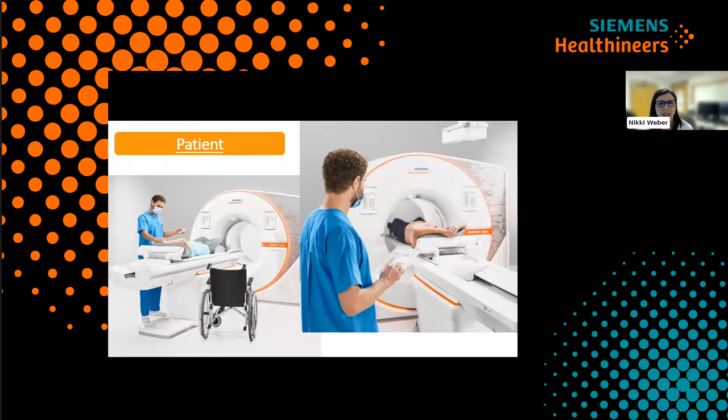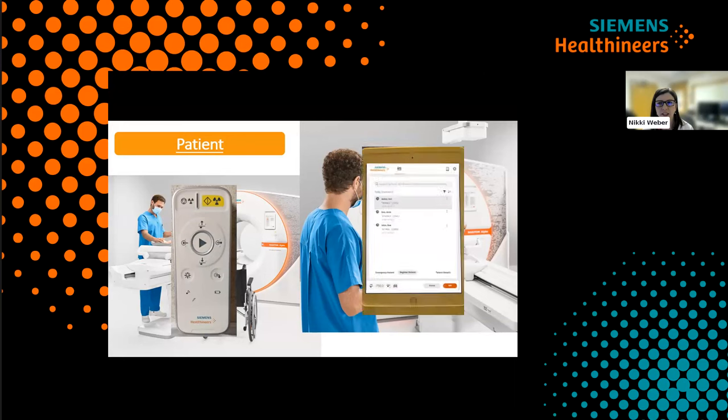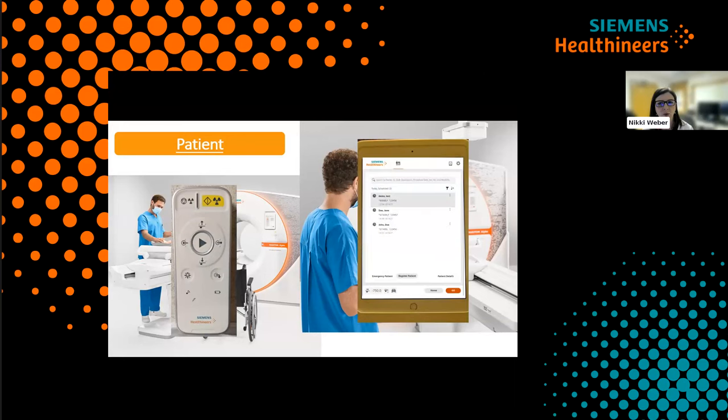So here, the Scan and Go workflow starts in the room when we greet the patient and set them up for their exam. The technologist on the left is focused on the patient's needs while moving the scan table using the remote. The technologist on the right is using the mobile tablet to set the patient up. This interaction between the patient and the technologist can put the patient at ease and help lower their heart rate.